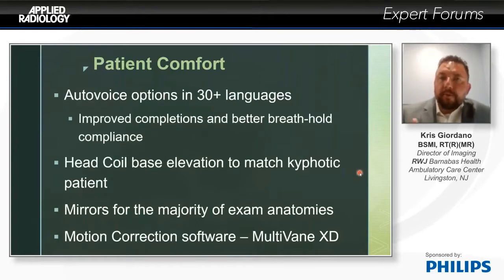And now we're not prone to, whether it's gross patient motion or simply popliteal artery motion, flow motion artifact. We can eliminate that altogether by not being so reliant on phase direction limitations. Now we're able to automatically mitigate that by having that standardization.